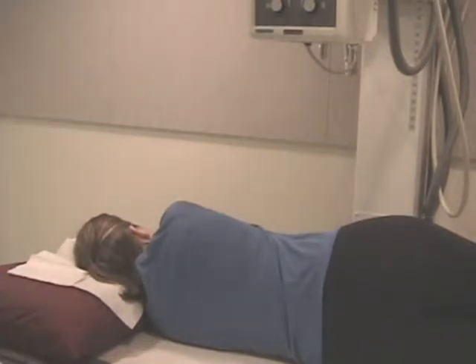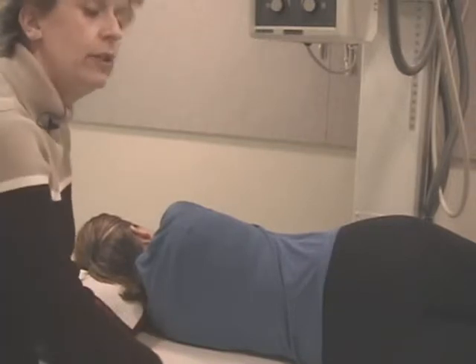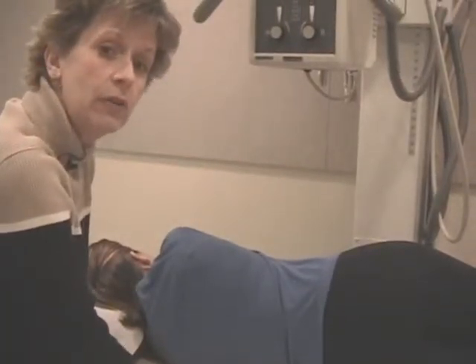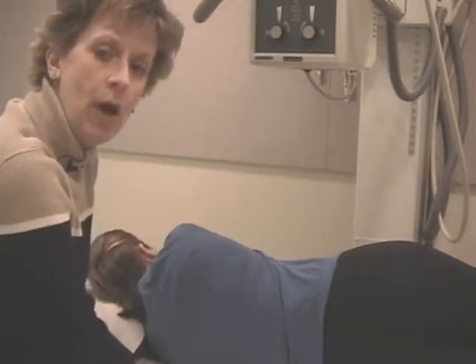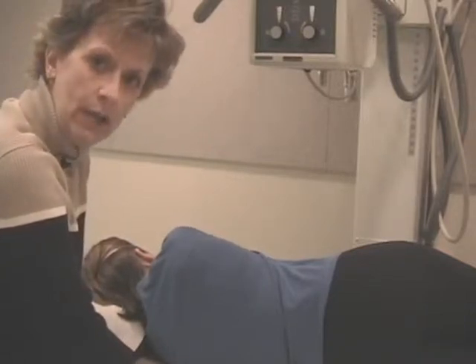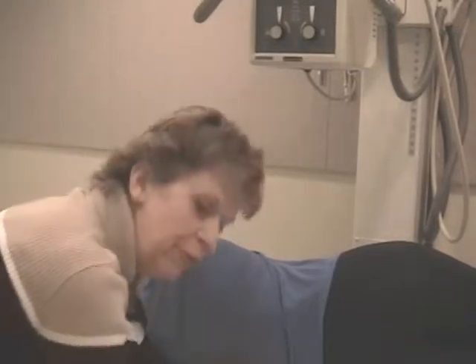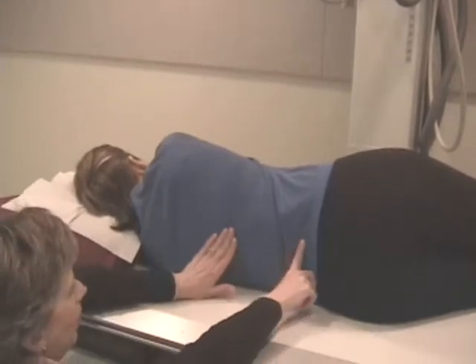What I'm going to want you to do next is you need to analyze patients' shapes. Is the spine parallel to the table? Is the spine crooked? You don't know. Every body habitus is a little bit different. So when you're first starting out, I want you to actually physically lower your position with the patient, and I want you looking at the spine.